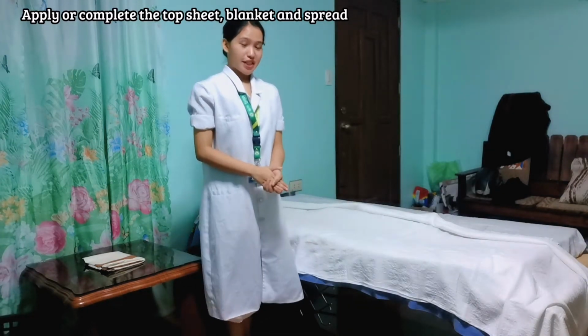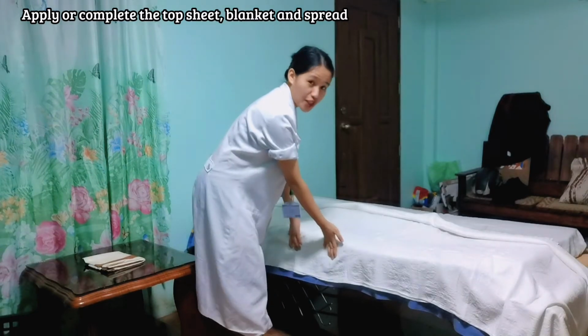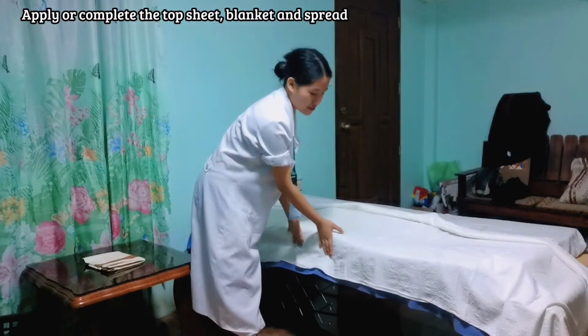And then we're going to tuck in the top sheet together with the blanket.